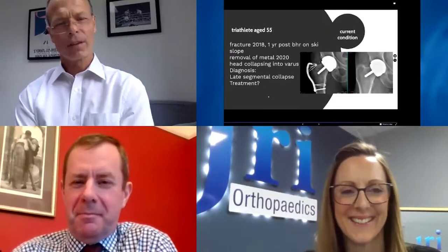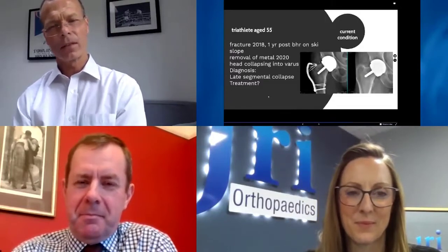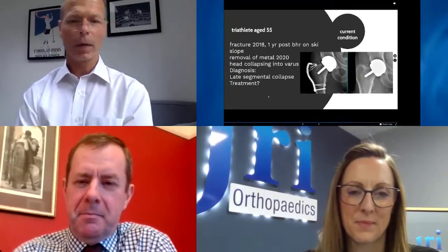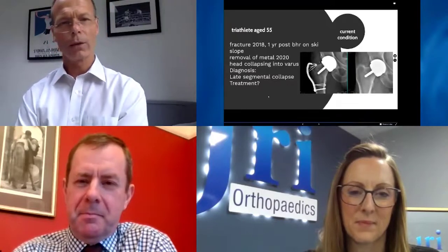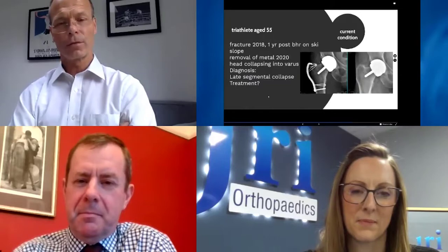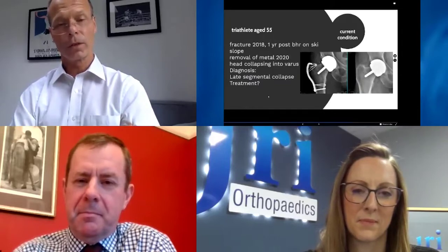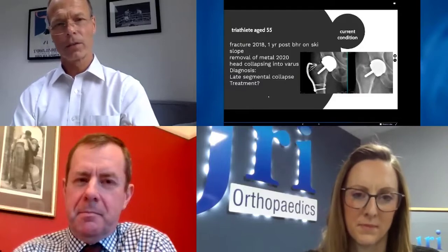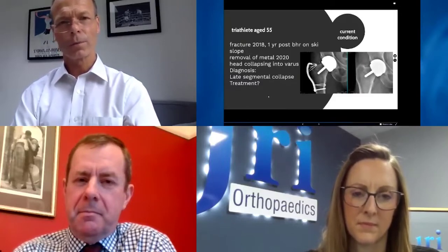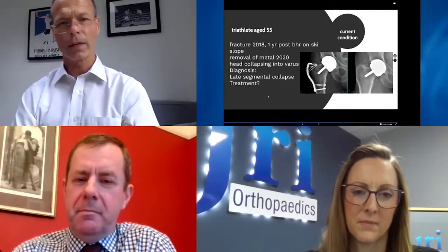Well, I guess the femoral head is maybe AVN, or obviously there's a metallosis issue that one might have to rule out. But ultimately, the hip resurfacings that I've revised, I've usually used an Evolution stem. I've taken out the cup and put a large head ceramic articulation. That's my standard revision for a failed hip resurfacing, I have to say.